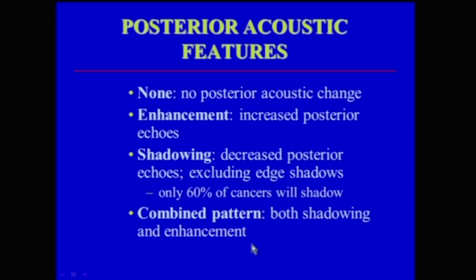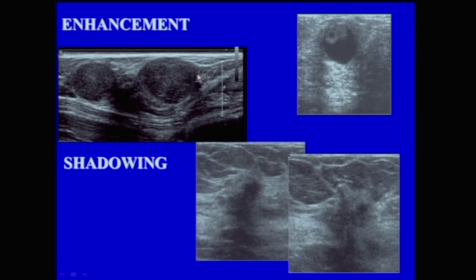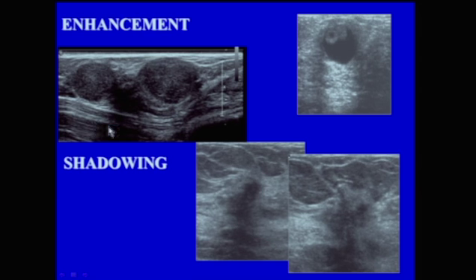Posterior acoustic features can include: no posterior acoustic change; enhancement with increased posterior echoes; shadowing with decreased posterior echoes — excluding edge shadows, seen in 60% of cancers; or a combined pattern with both shadowing and enhancement. Three different patients are shown: one with no significant posterior acoustic features; one with a cystic and solid component mass with prominent posterior acoustic enhancement; a third with an irregular mass showing posterior acoustic shadowing; and a fourth mass with apparent combined shadowing and enhancement.